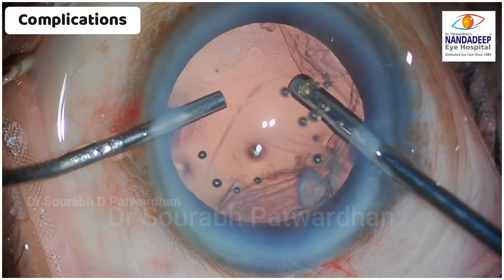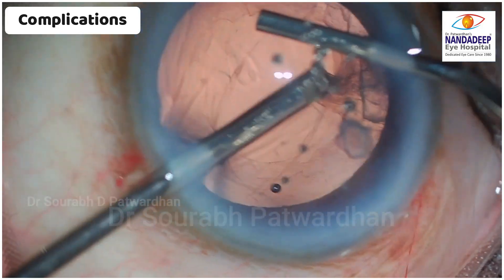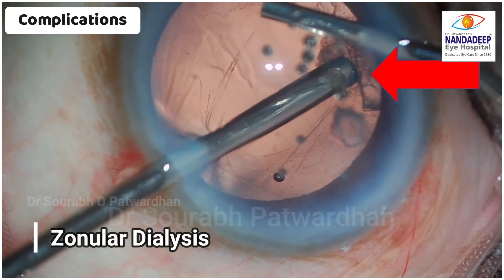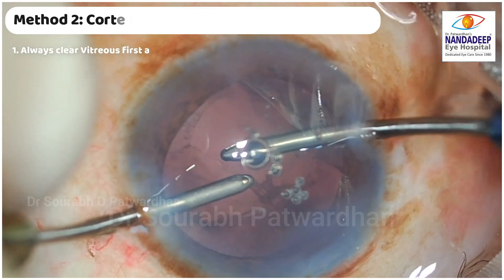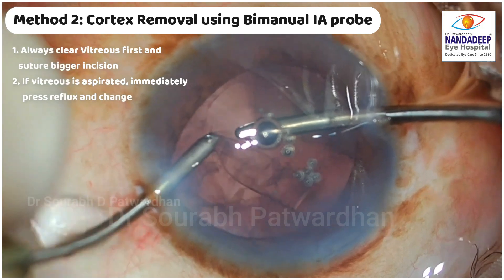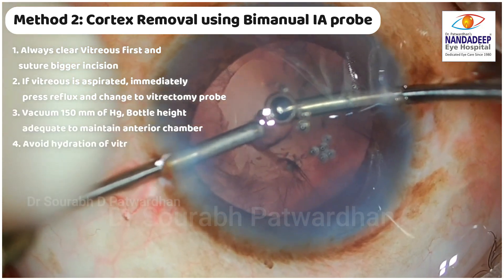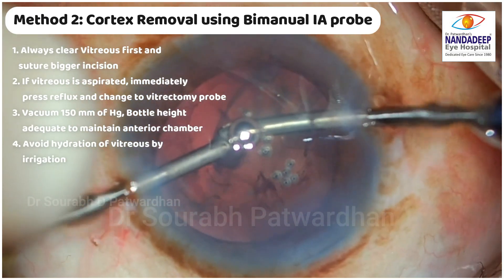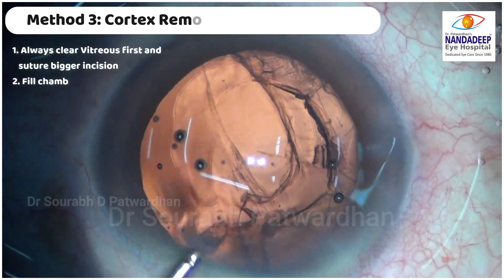Always be careful while removing cortex using the vitrectomy probe. A good advantage of the vitrectomy probe is that whenever a vitreous strand comes in, you can immediately cut it. The second method is to use a bi-manual IA probe for removal of the remaining cortex. This should be used only once you are thorough with the anterior vitrectomy — there should be no vitreous in the anterior chamber when you shift to bi-manual. If the bi-manual catches vitreous at any time, shift back to vitrectomy.